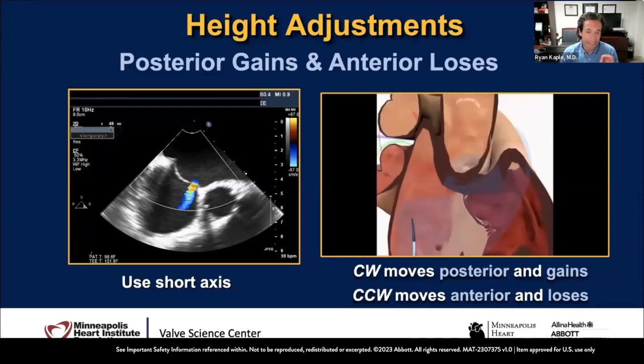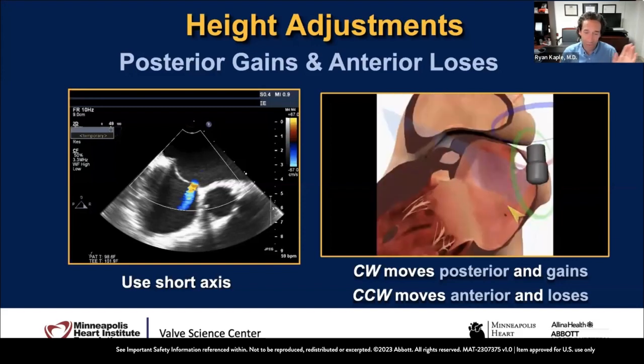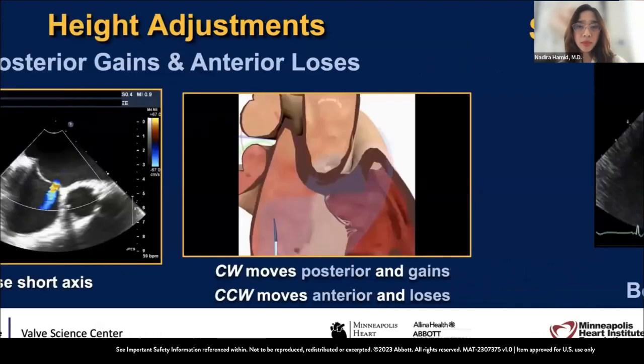So really, up until the last moment, until you buzz it, you can move. So check and recheck and empower each other to allow the other person to take their time. That goes for the whole procedure. You're really a team throughout the whole procedure, and giving each other the latitude to be confident about the decision making is key. Absolutely. I hear you, Ryan, and I'll wait for you and you for me. Vice versa, it's a team effort.